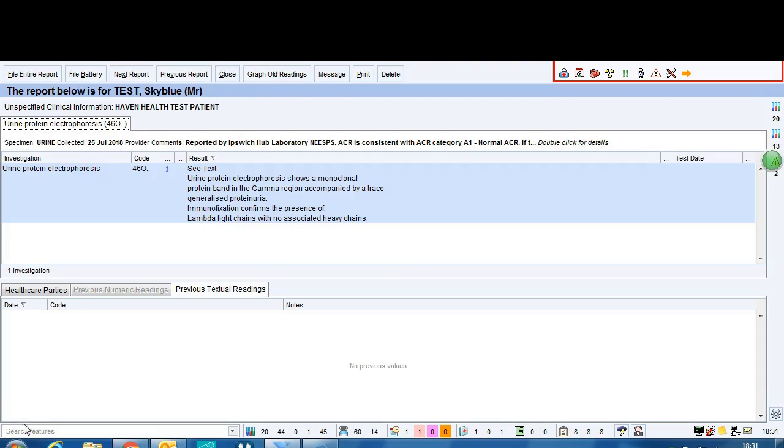So here we have a different urine test. This is called protein electrophoresis. Basically this is usually difficult to interpret. I use a lot of difficult words here to explain things. This is basically positive. They found something here, but generally speaking, most of the time you're going to be passing these on.